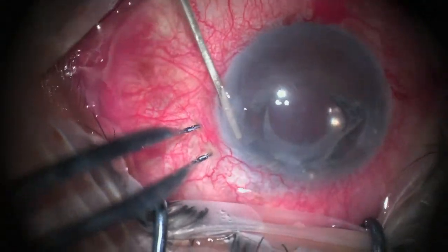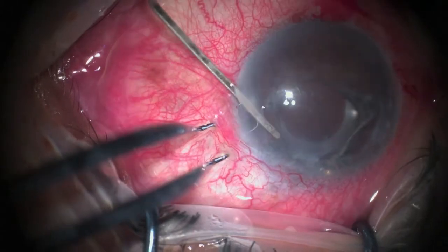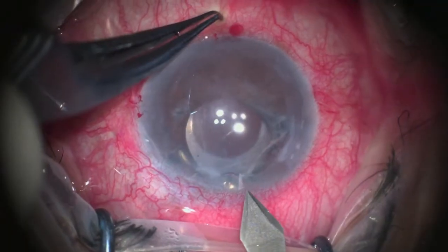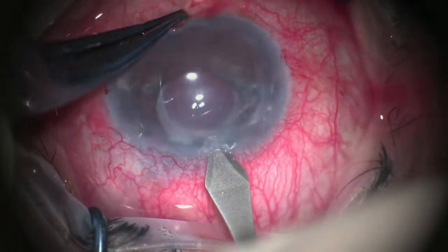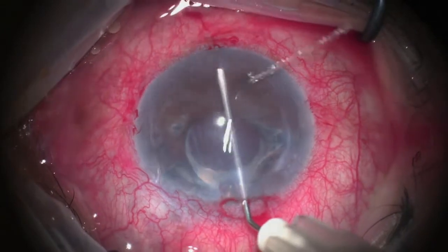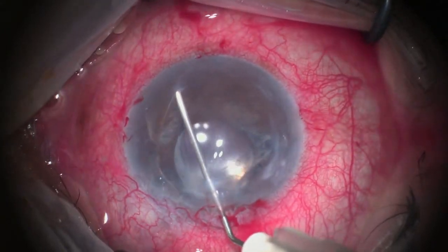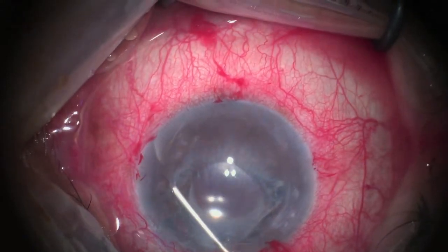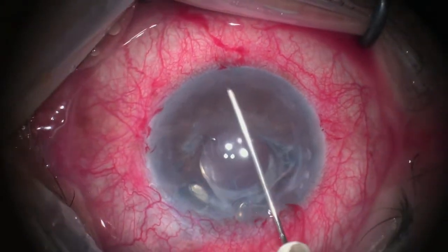Now our main 3 mm incision is created and scoring of the diseased Descemet membrane is done. Usually we begin at 6 o'clock and then score the Descemet membrane to either side.